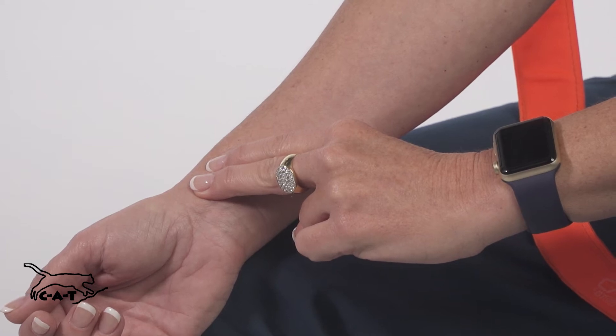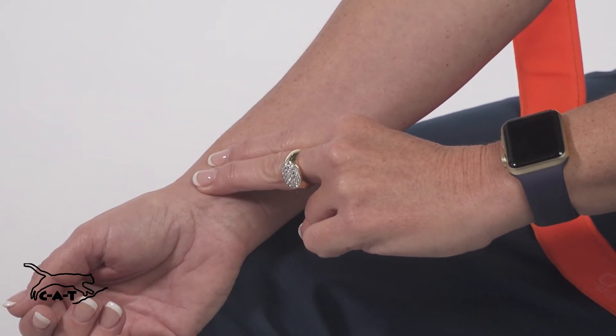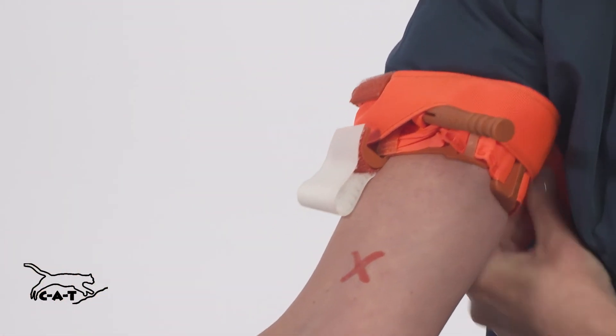If you're not able to stop the bleeding, consider applying a second CAT immediately above the first. Route the band between the clips and over the rod.